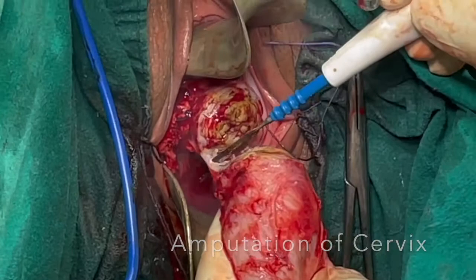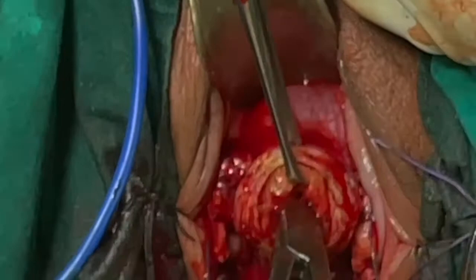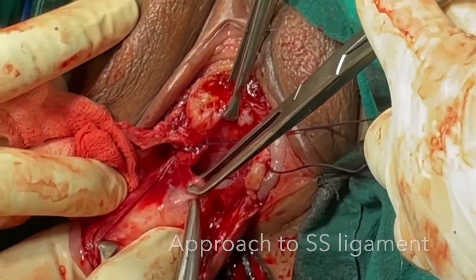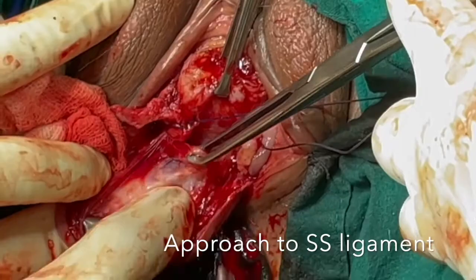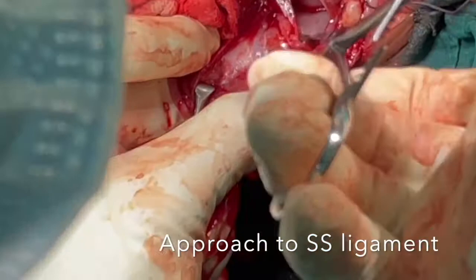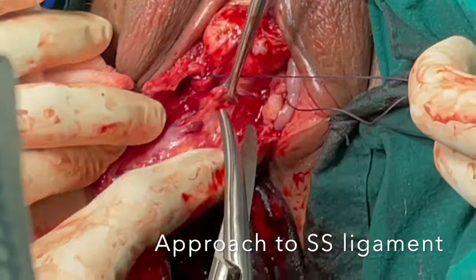Remember, the cervical canal should be loose and adequately dilated, because while performing the Sturmdorf suture, the vagina is supposed to be pulled inside the cervical canal. This case had a marked enterocele, and while dissecting, the enterocele sac got opened up. You can see we are separating the enterocele sac. If the patient wants tubal ligation at the same time, it can also be done through this opening.